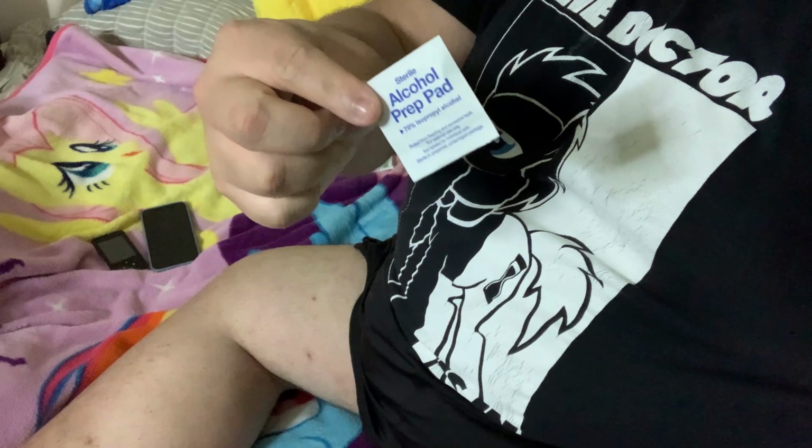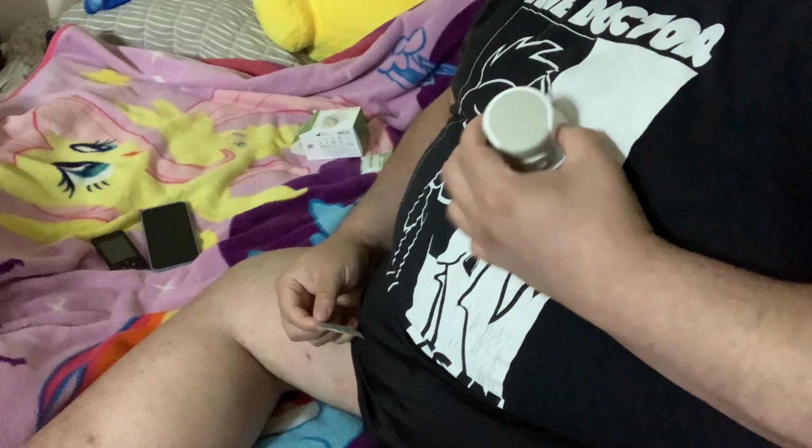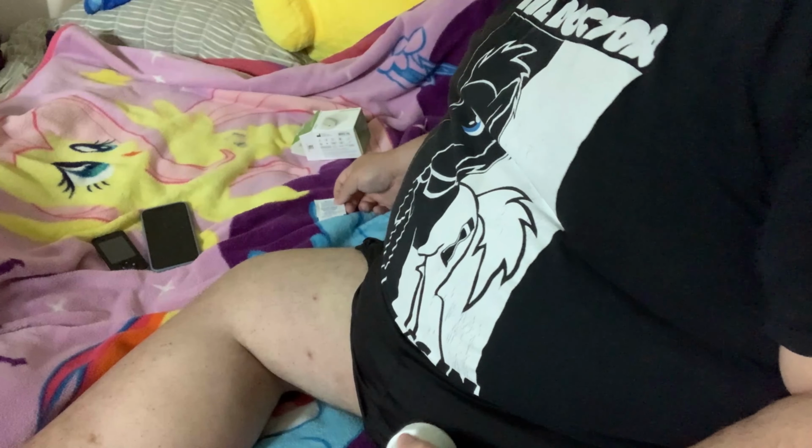All right, so I forgot one thing, and I'm going to come back real quick, and hopefully I can get it. And hopefully I don't forget anything else, because I hate forgetting things. All right, so the one thing I forgot is an alcohol swab, so I had to run to get that real quick. And again, if you guys see the receiver code, it's not going to work anymore after this video because it's already paired on my devices. And hopefully I don't get in trouble with both platforms.